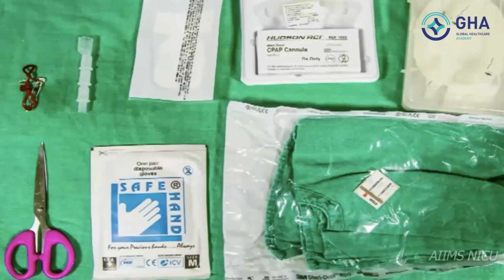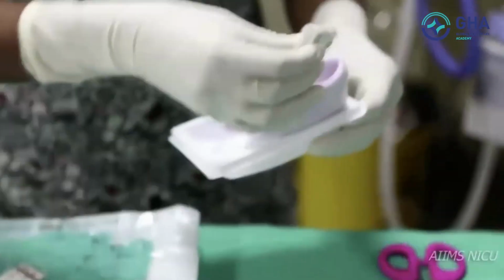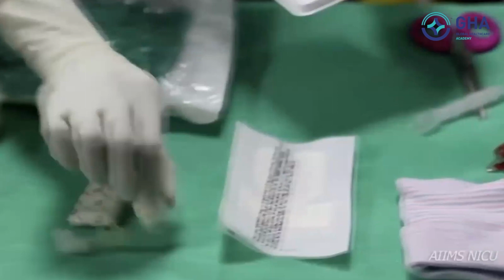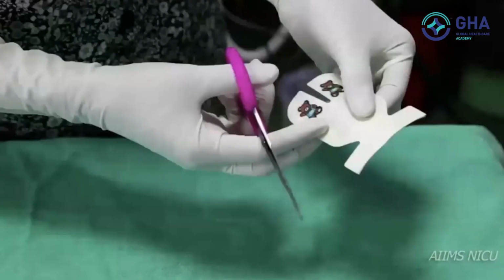Assemble the Hudson prongs of appropriate size, gloves, green sheet, scissors, rubber bands, safety pins, tegaderm, and a few connectors. Find the Hudson prongs, Velcro, and connectors in the prongs kit. Cut a strip of tegaderm.